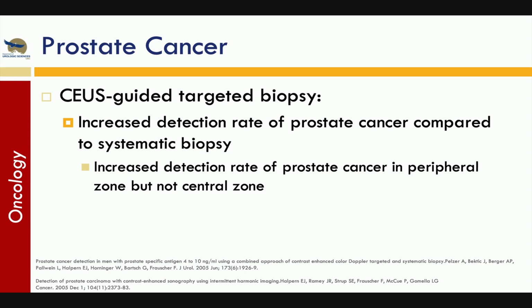And moving on to prostate cancer, there's also a lot of studies looking at contrast enhanced ultrasound guided targeted biopsy. It has not gotten as much traction as fusion biopsies, but there are two papers that reported an increased detection rate of prostate cancer using contrast enhanced ultrasound compared to just systematic biopsy.